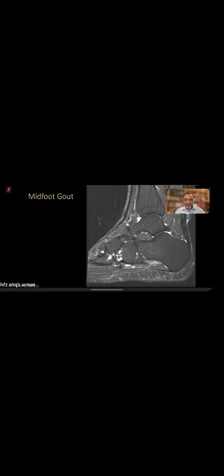Somebody asked, what is your favorite MR sequence for gout? There's no favorite sequence for MR scan for gout for me at all. I tend not to do MR for gout because it just confuses you more. You may wonder why we see these cases sometimes: it's because we are a tertiary center. We get these cases from the periphery and we look at them when everything has been done. So generally, if we know it's gout, we'd never do MR at all.